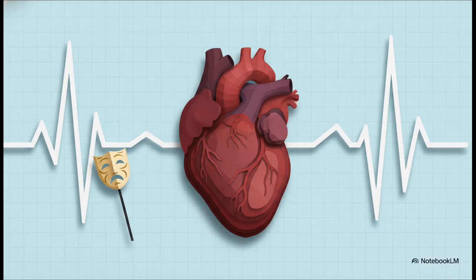But if the left atrium is the one struggling, it stretches out into this broad, double-humped notch known as P mitrale. Now, when the lower ventricles massively thicken, they generate some seriously huge voltages on the ECG. Right ventricular hypertrophy gives you a very tall R wave in V1. But left ventricular hypertrophy creates these massive R waves on the left side and incredibly deep S waves on the right. More importantly for us, LVH often shows an ST strain pattern with ST depression and T-wave inversion.